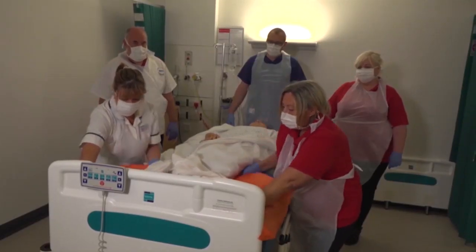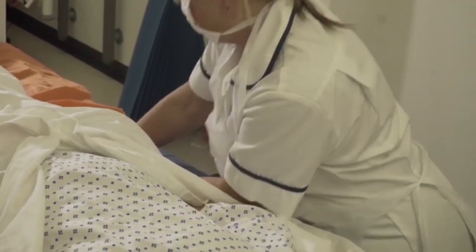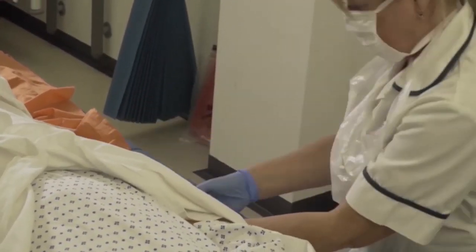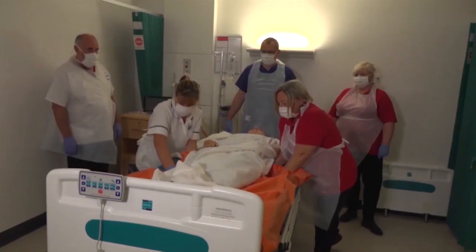Ready, steady, pull. We're going to move up the bed. Ready, steady, pull. Ready, steady, pull. Underneath the hip area may require a little bit more pressure. Ready, steady, pull.